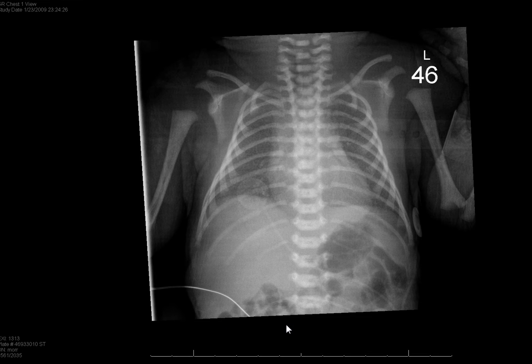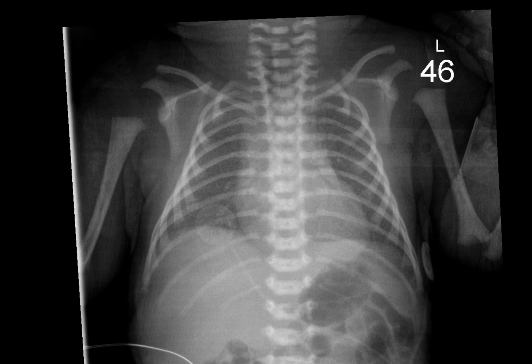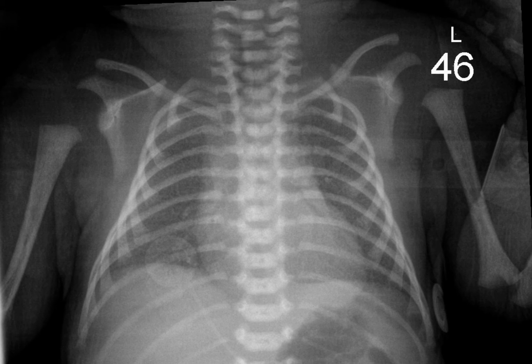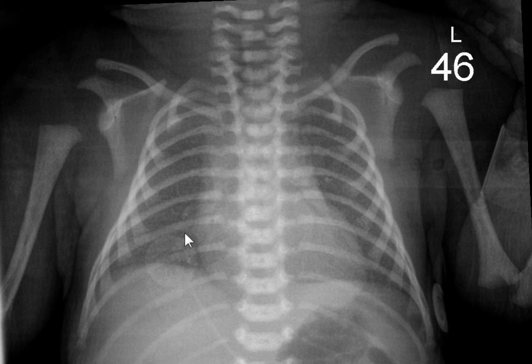This is a premature baby that we would read as mild hyaline membrane disease. There's just a very fine granularity noted throughout both lungs. Notice the lungs are symmetrically involved. There are a few air bronchograms, but not many, so this would qualify for mild hyaline membrane disease. I'll remind you of the caveat that congenital pneumonia and hyaline membrane disease can virtually look identical on x-ray, except if you see pleural effusion. Hyaline membrane disease should never have a pleural effusion. Neonatal pneumonia, especially if it's beta strep, the most common organism, may have a pleural effusion.